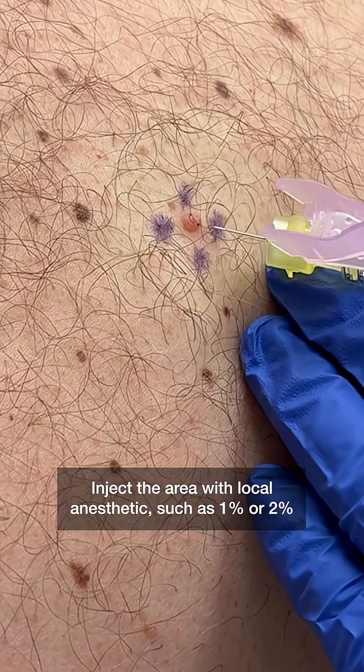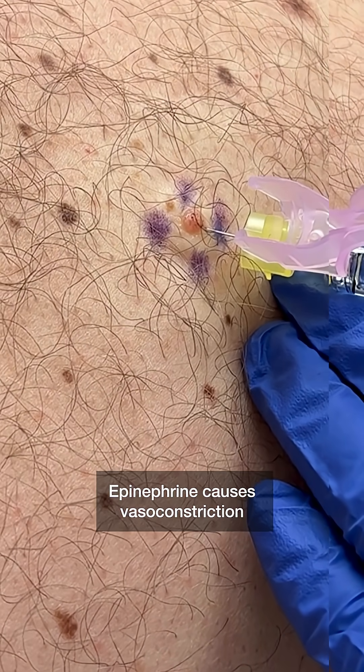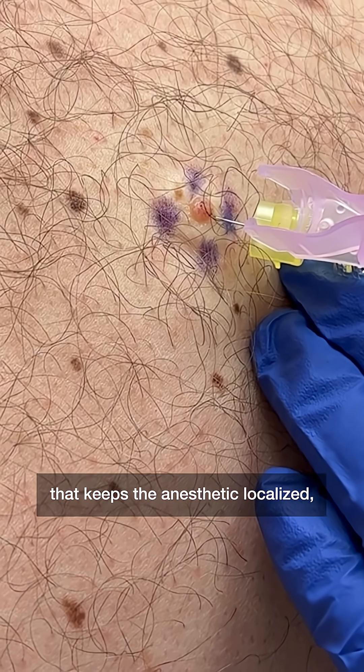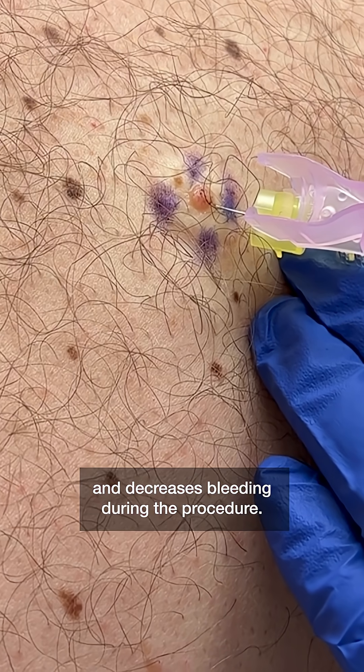Inject the area with local anesthetic, such as 1% or 2% lidocaine with epinephrine. Epinephrine causes vasoconstriction that keeps the anesthetic localized, which prolongs the anesthetic effect and decreases bleeding during the procedure.